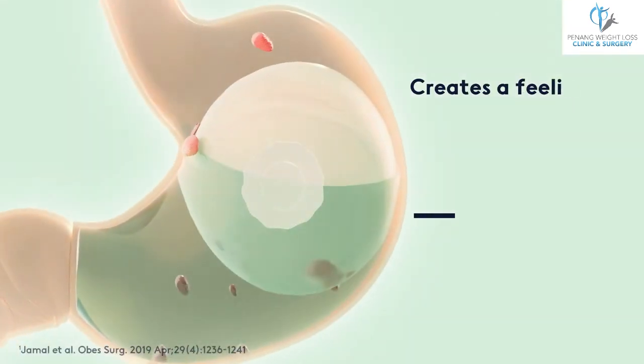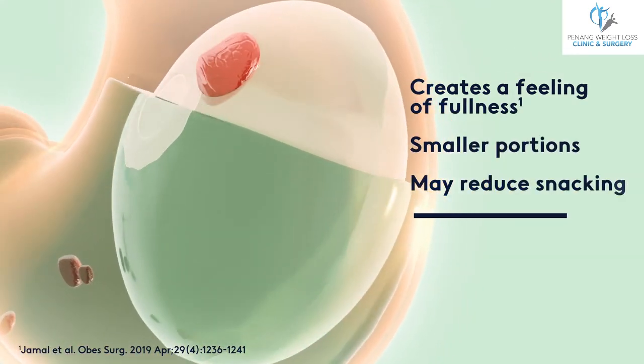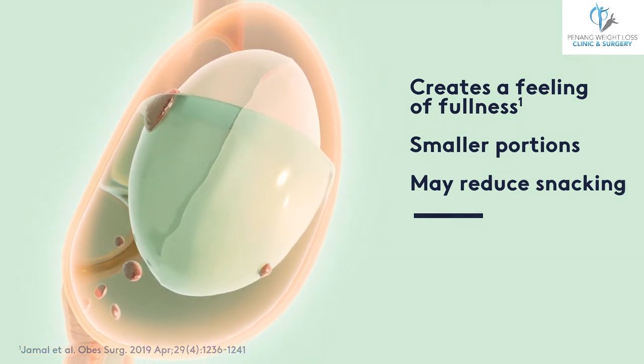While in the stomach, Ellipse helps to reduce your food intake by taking up space in the stomach and may delay gastric emptying for a feeling of fullness.